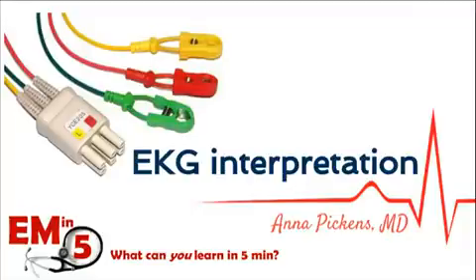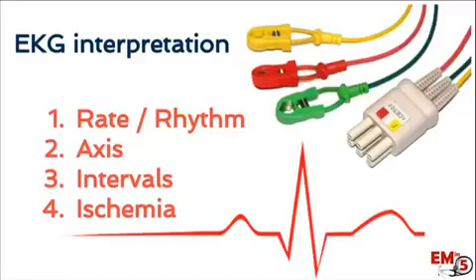Today we're going to talk about EKG interpretation. So you're going to look at the rate and rhythm, the axis, the intervals, and then for signs of ischemia.